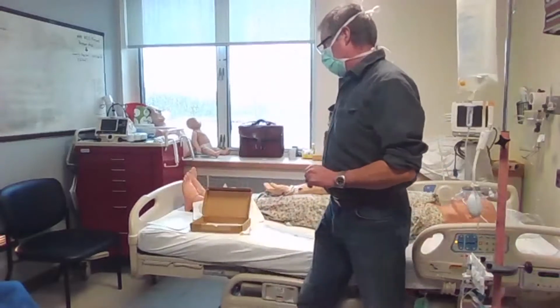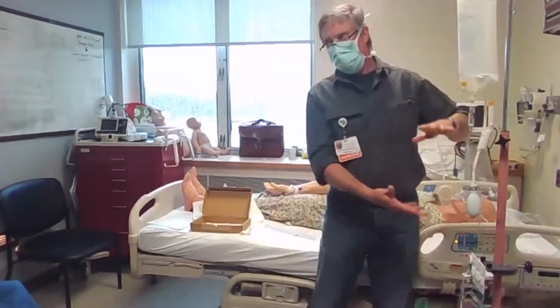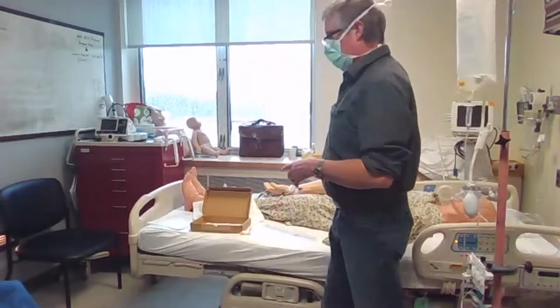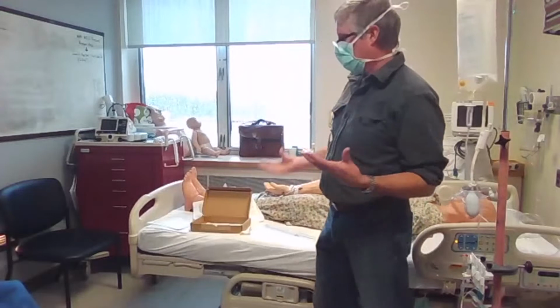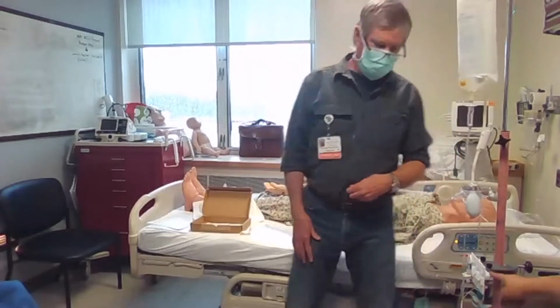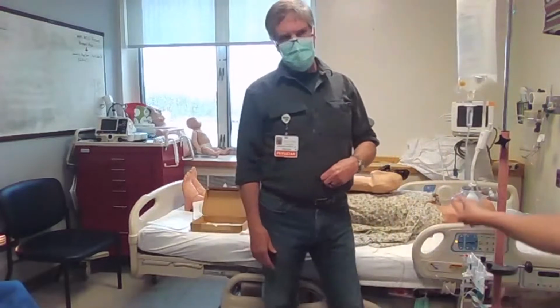The patient moving isn't as big a deal as this moving, obviously. So 15 centimeters, 10 up or down. If the patient moves, they're going to go up and down, but this is still here, and it's still measuring there. So it's not as big a deal. It's a big deal if the device itself moves, not a big deal if the patient moves.